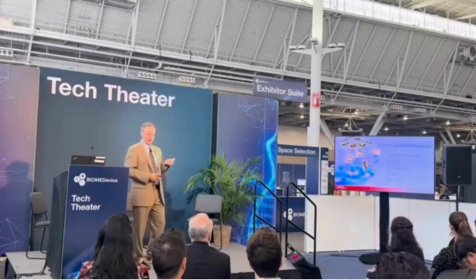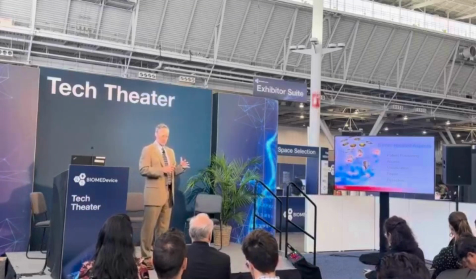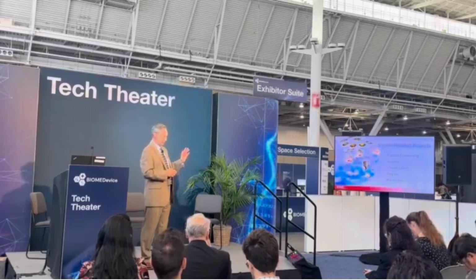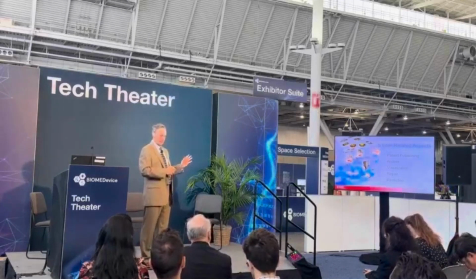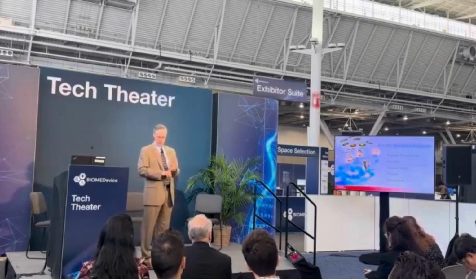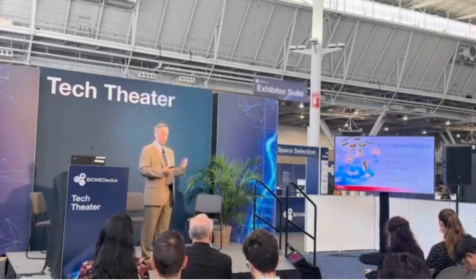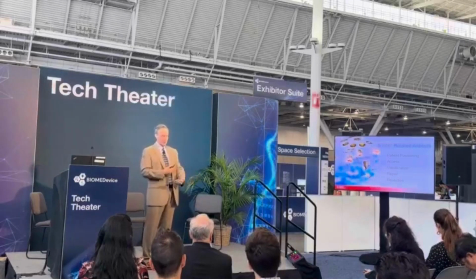So these are the 5 aspects that I've distilled down to think about as you're developing your devices and techniques. I've covered patient positioning pretty well, I think. It comes back at the end. And there's also, you need to access the joint space, you need to be able to see something once you're in there, or the space in the anatomy, you want to be able to do something. You want to take something out, or you want to fix something. So you're resecting or you're repairing.